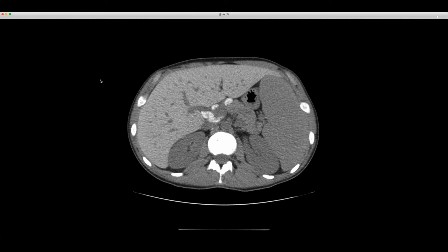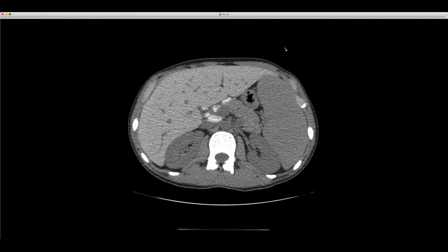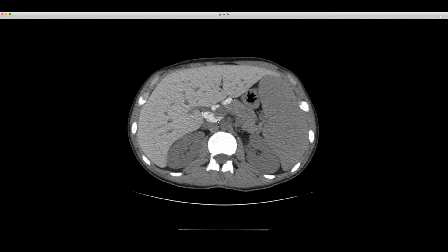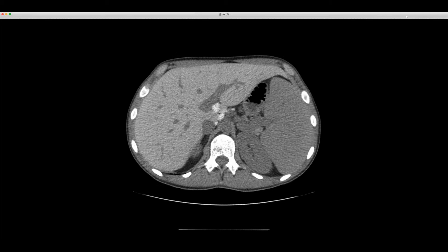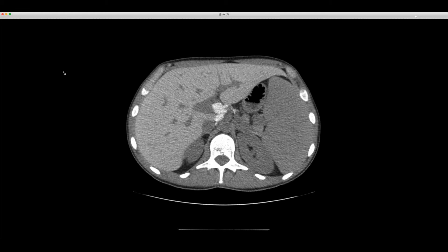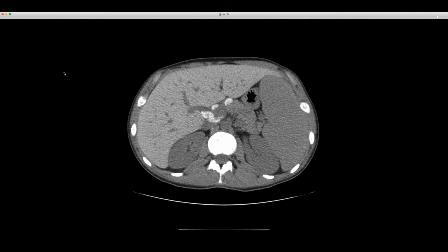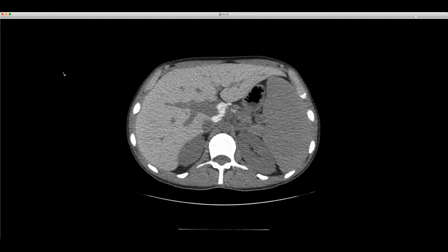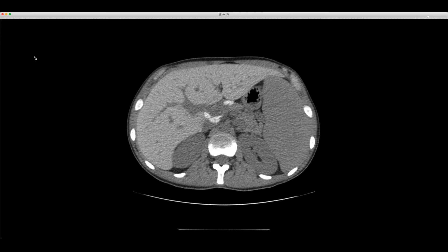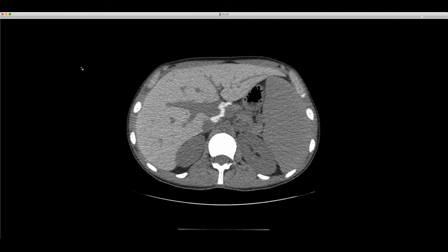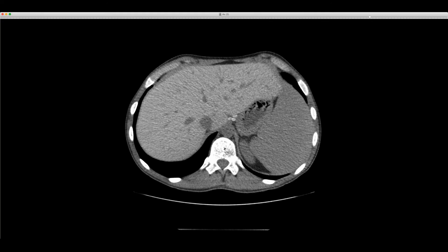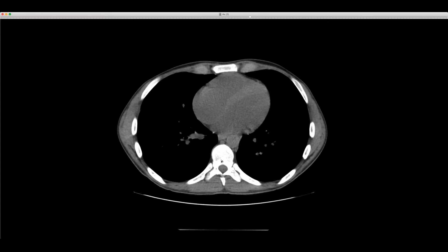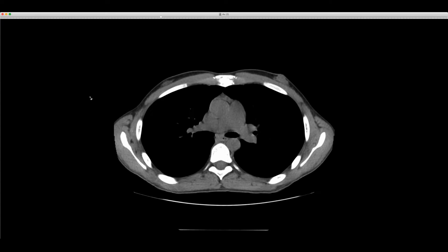The high attenuation porta hepatis lymph nodes presumably reflect iron deposition, as they drain the liver. This iron overload from chronic transfusions causes not only high attenuation liver but also these dramatically high attenuation lymph nodes. The presenter notes they haven't seen many dramatic cases like this, though similar findings are published. A discussant confirms iron deposition within lymph nodes has been described, and mentions a prior Grady case of sickle cell disease with similar lymph nodes.